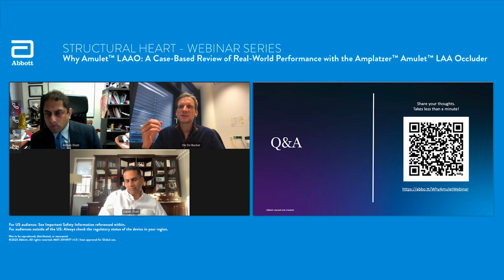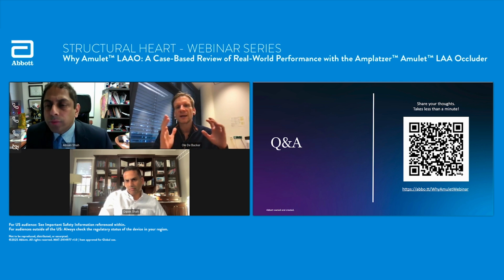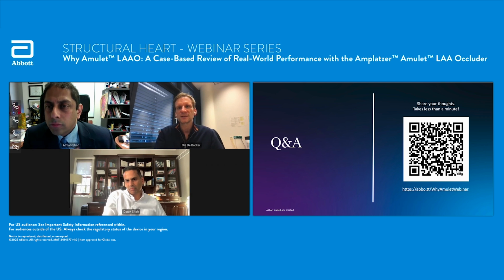What you get out of this is you see the compression, you see if the anchoring is proper enough, but they also simulate what the risk is for peri-device leak. So this gives really extra information. How I use it, it's not that the simulation necessarily tells me this is the one and only to go, but I can exclude options. I know up front, for example, okay, an Amulet 25 is not going to give me any compression, so you don't have to try this even on your case. So typically I end up with maybe two configurations that I know are possible options, and I try to perform and execute that during the case.